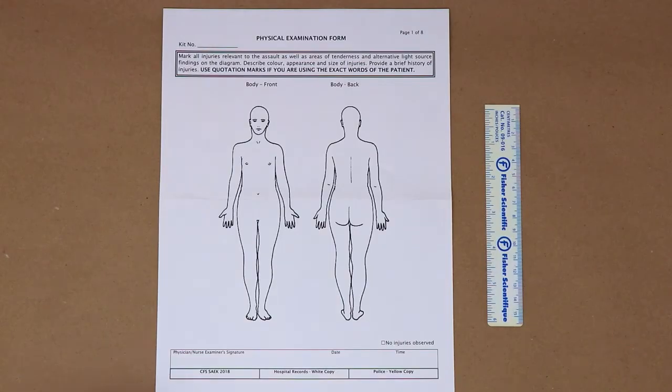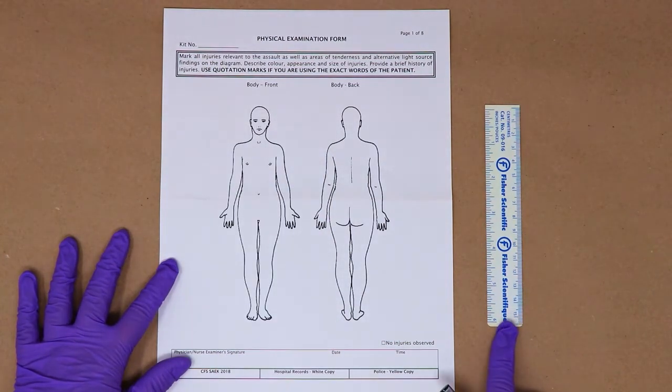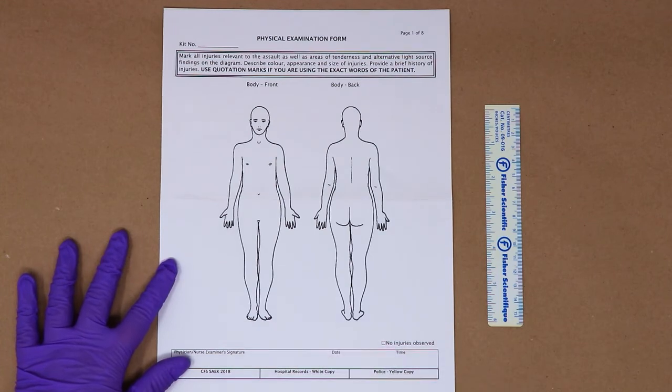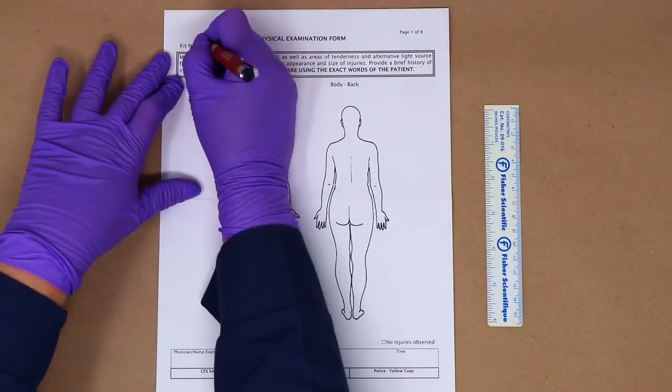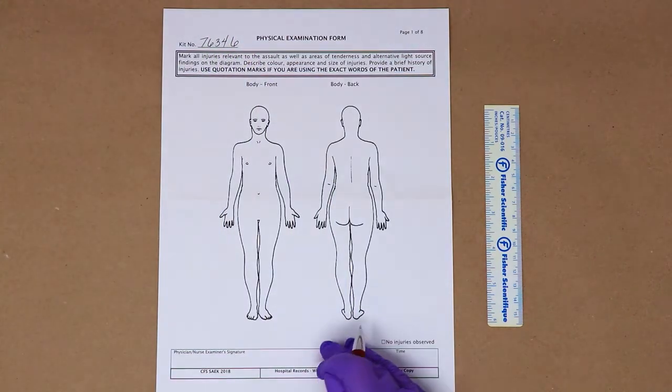Physical examination form. The sexual assault kit number found in the upper right-hand corner of the kit should be included on each page of the physical examination forms. A ruler can be used to measure the size of any marks or areas of redness noted. The physical examination form is used to mark all injuries relevant to the assault, as well as areas of tenderness or pain.